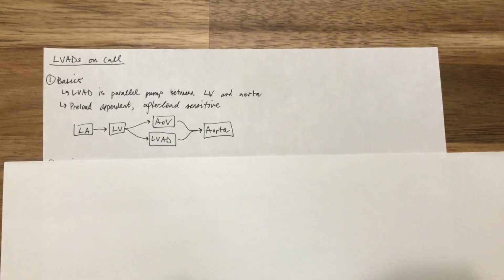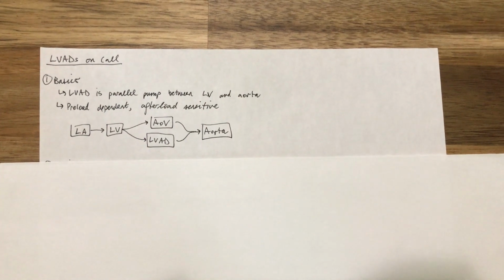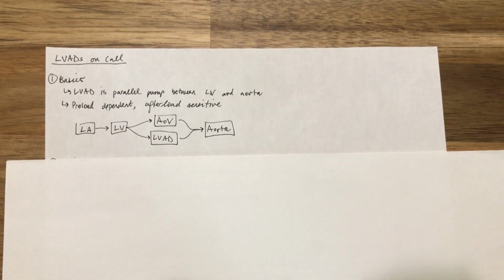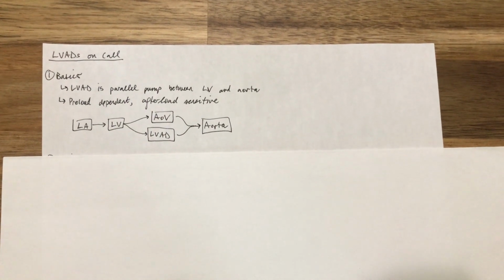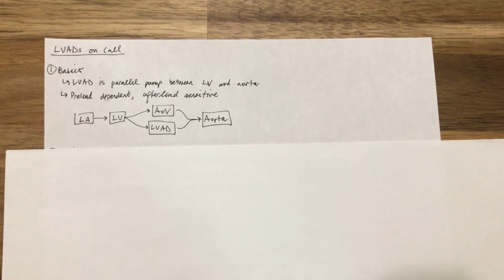For talk number 10, we're going to talk about how to deal with durable LVADs on call. Talk number 9 was about percutaneous LVADs placed in the cath lab. This talk is about durable LVADs placed via sternotomies in the operating room.